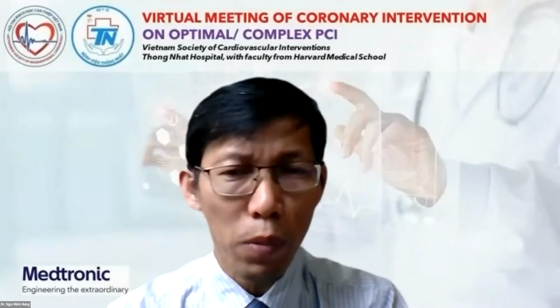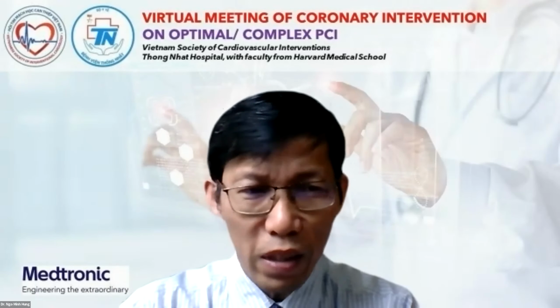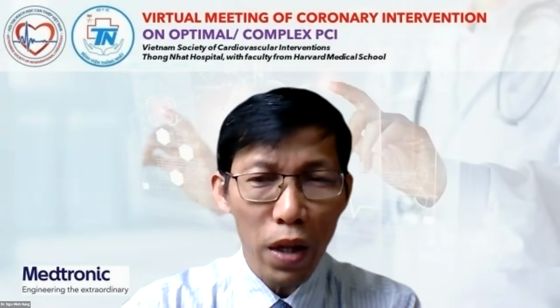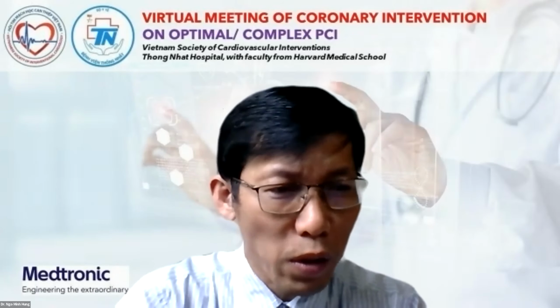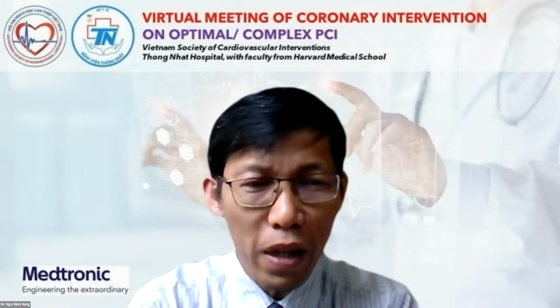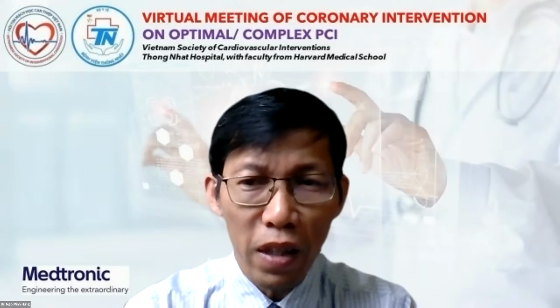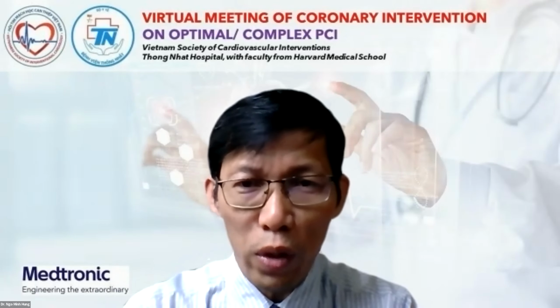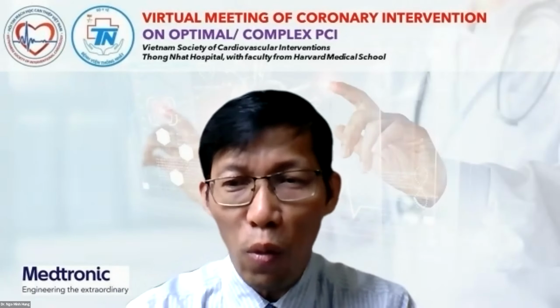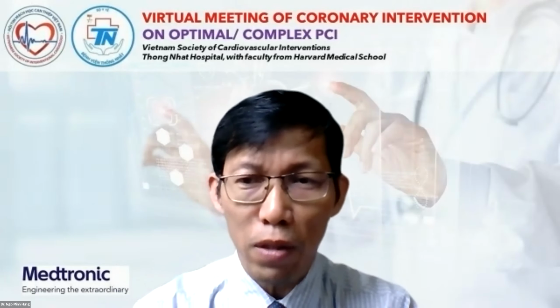Thank you very much, Dr. Pinto. And I think, sorry, Dr. Watson, I want to have another opinion from Professor That Nguyen: is there any difference between concentric and eccentric ISR? If you deal with that kind of ISR, what is the difference between the concentric and eccentric? Thank you very much.